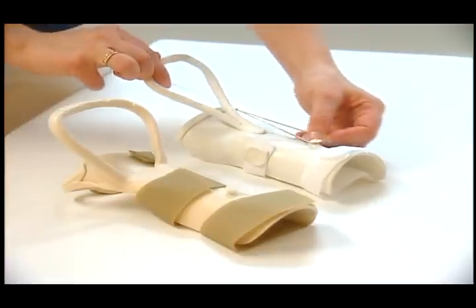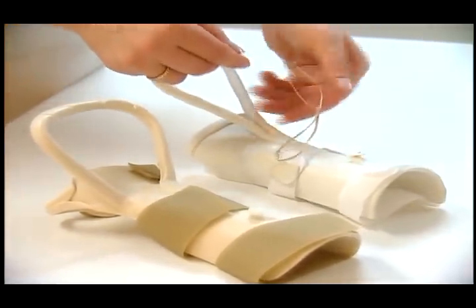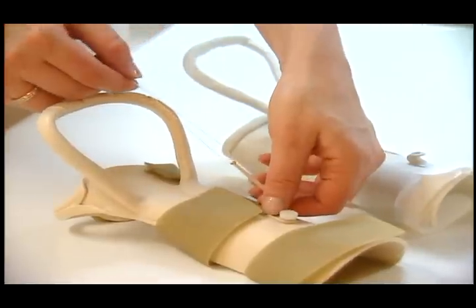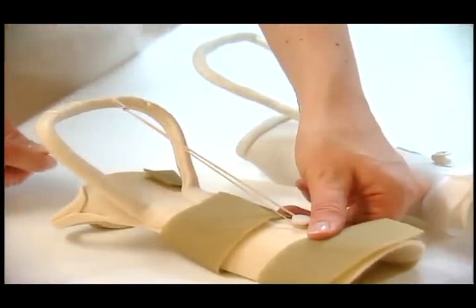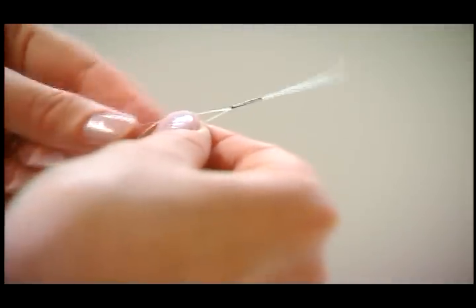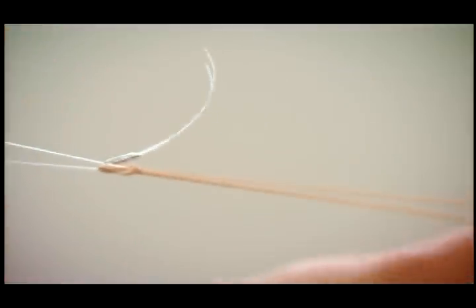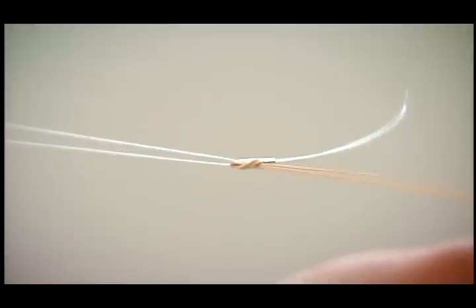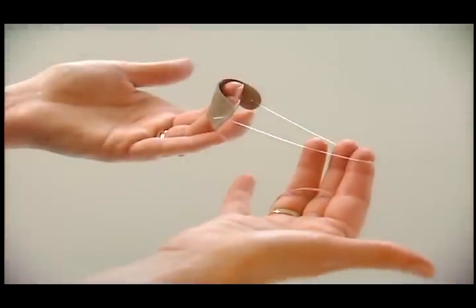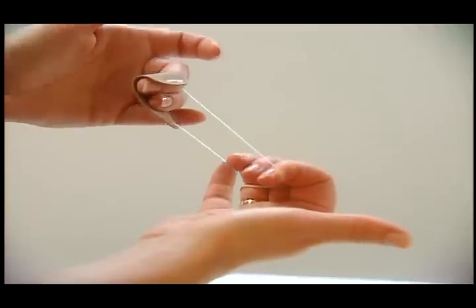The tension of a dynamic splint is provided by rubber bands, coil springs, or elastic thread. These can be attached to the splint base with Velcro tabs, hooks, or knobs that are placed proximal to the outrigger. Monofilament or fishing line is attached to the rubber band to create a smooth excursion as it pulls over the outrigger. This can be done using fishing knots or crimpers on the monofilament and attaching the rubber band securely around it. There are also commercially available finger slings that come with monofilament loops attached.